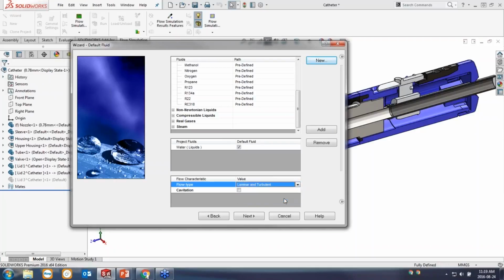With this setting, laminar and turbulent, we let the software figure it out for us. It makes sense that the software can calculate Reynolds number and can determine where there's laminar flow and where there's turbulent flow. I don't have to be a specialist to know what the effect is going to be ahead of time. This cavitation option, if I think there's going to be issues with that, I can turn that on.